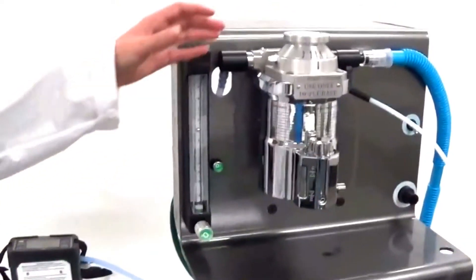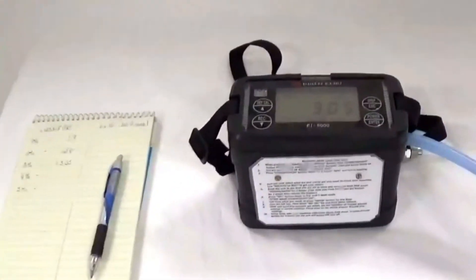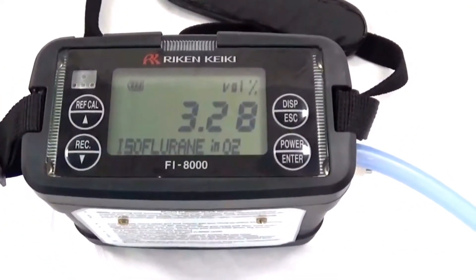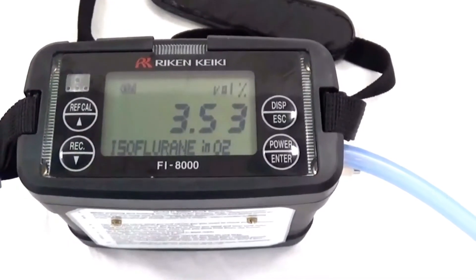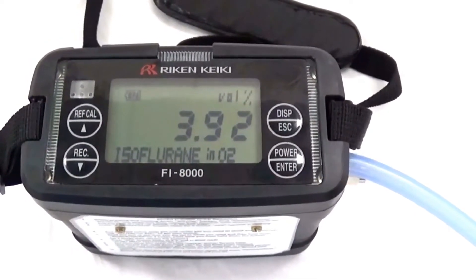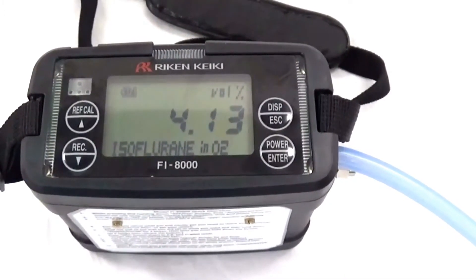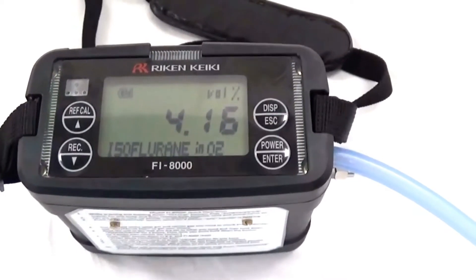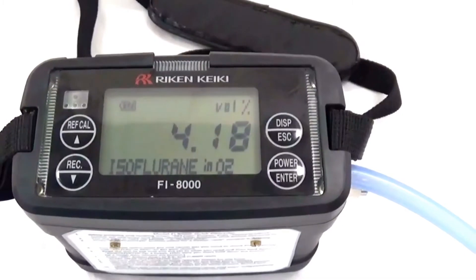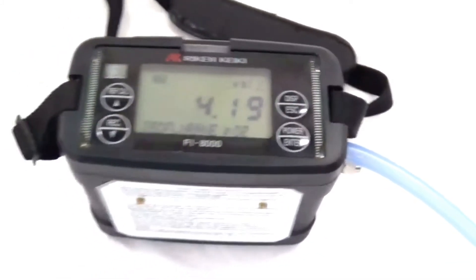Now adjust the vaporizer to 4% and verify the readings. We are at 4.18, 4.19. We will record 4.19.